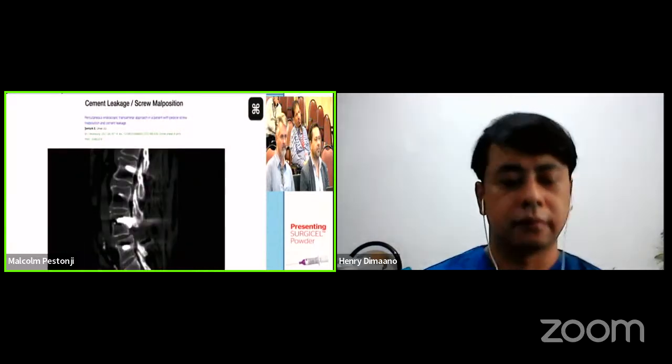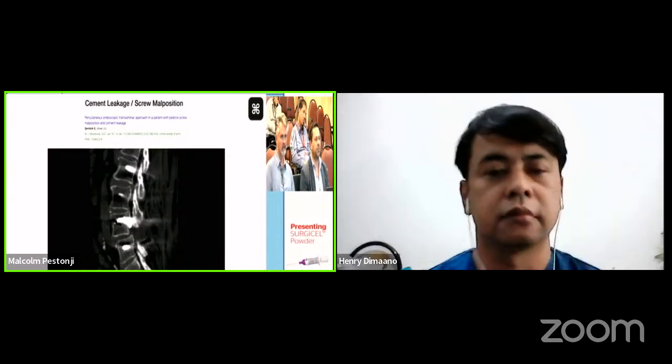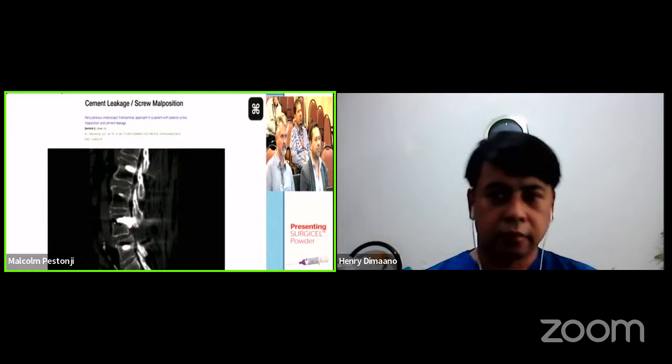Another part, cement leakage with screw malposition. It is an option for us. If you get this type of pathology, you can solve these pathologies percutaneously with a percutaneous endoscopic approach.